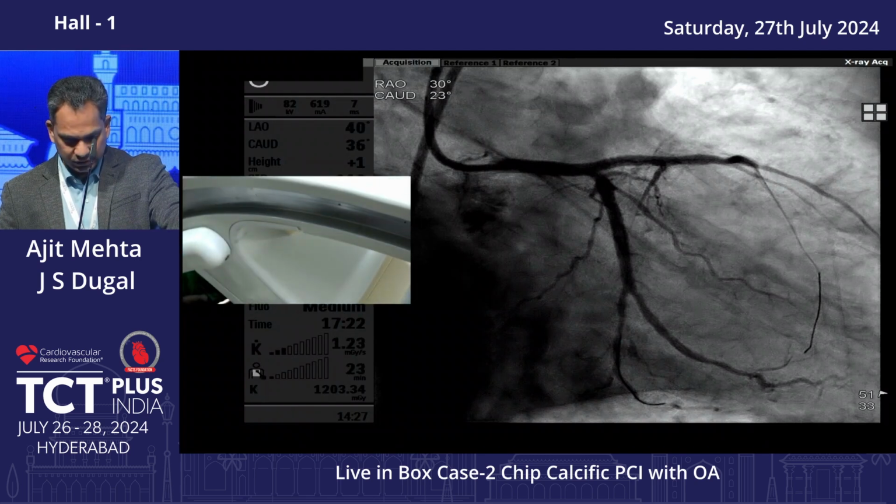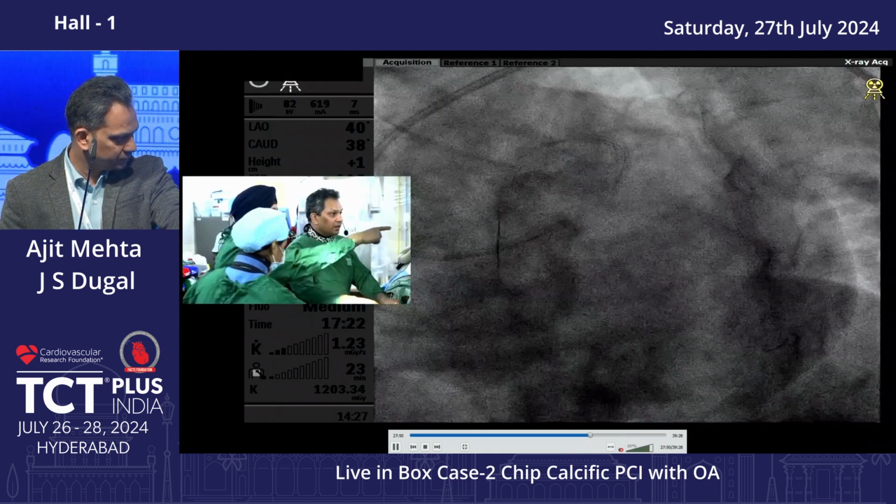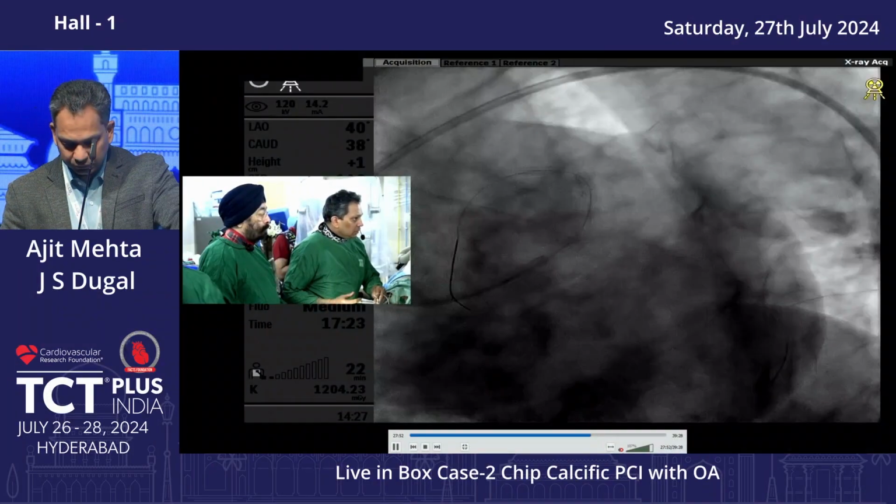Yeah. Is it the distal LAD has some spasm or something going on down there too?